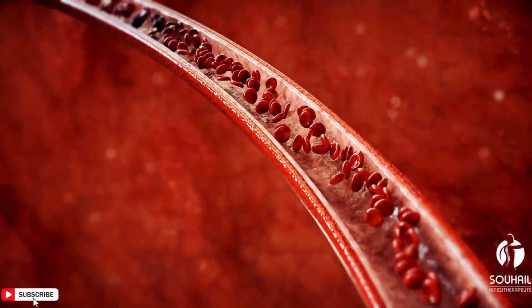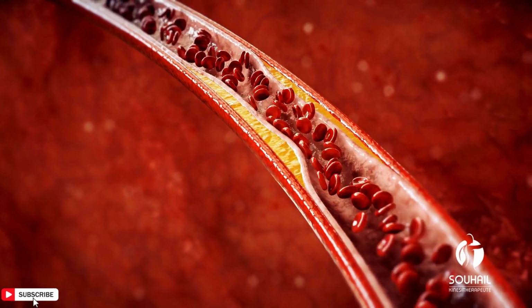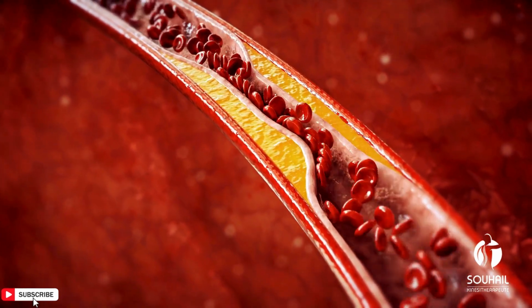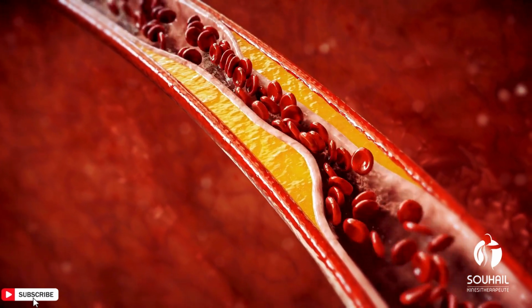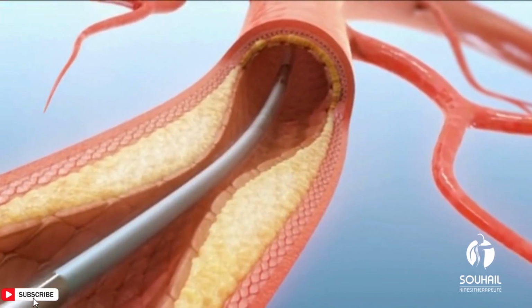Angioplasty is a medical procedure used to widen narrowed or obstructed blood vessels, primarily arteries. It is commonly performed to restore blood flow to the heart (coronary angioplasty), or to other parts of the body such as the legs (peripheral angioplasty), or the brain (carotid angioplasty).